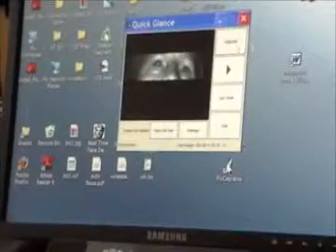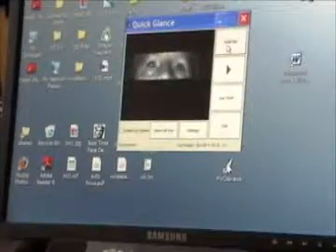Now I will show you how the calibration works. We click on the calibrate button and then it shows a series of targets on the screen. I just stare at the center of each target. This step teaches the system how to read my eyes and correlate them to points on the screen.